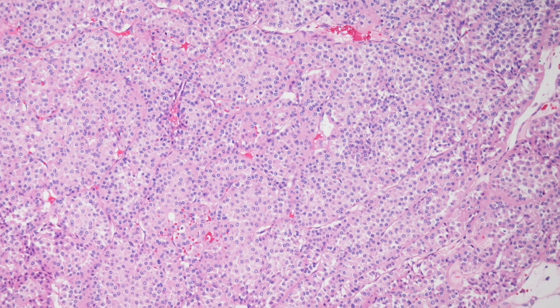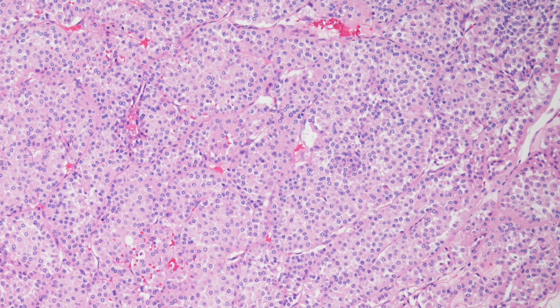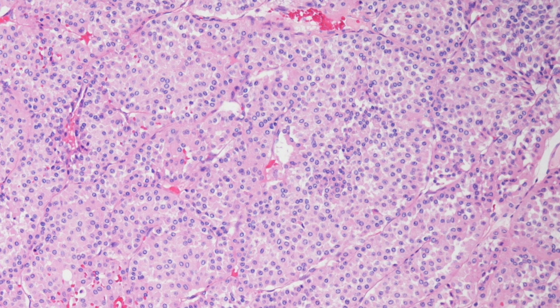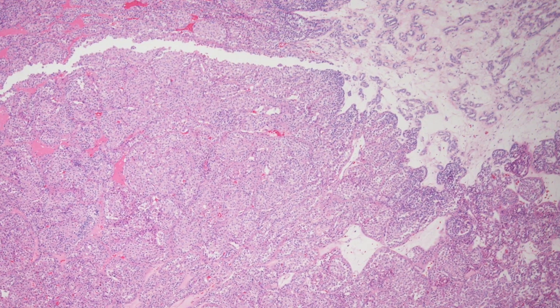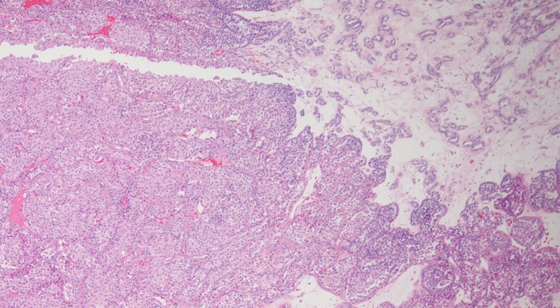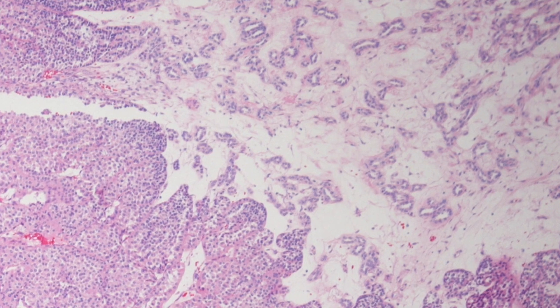On low power you can appreciate the pink staining abundant cytoplasm and a tubular and nested pattern here. In this field we are zooming towards a hypocellular, rather myxoid area, typical of oncocytoma.